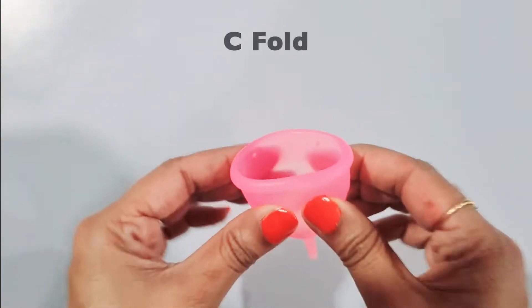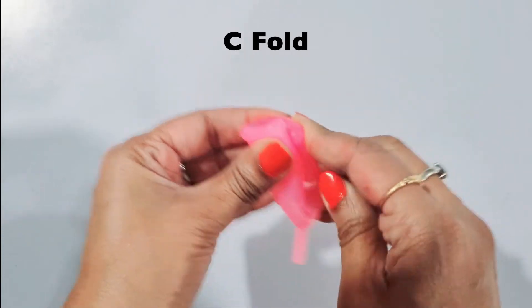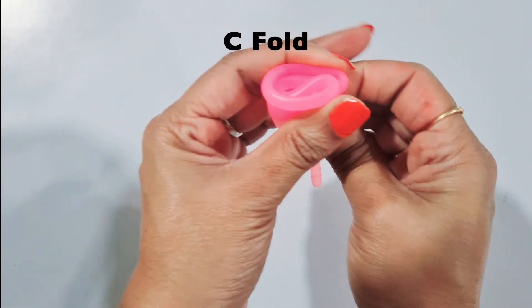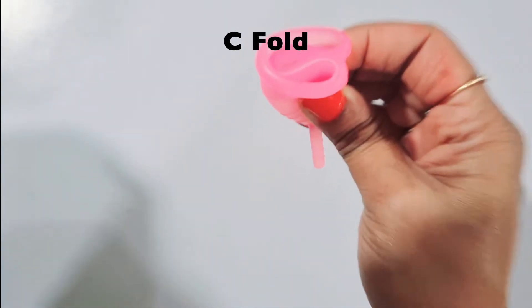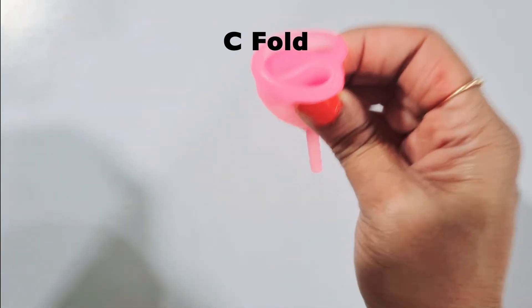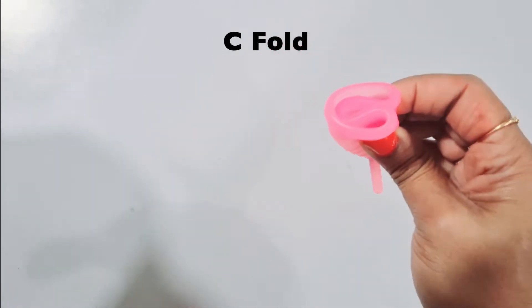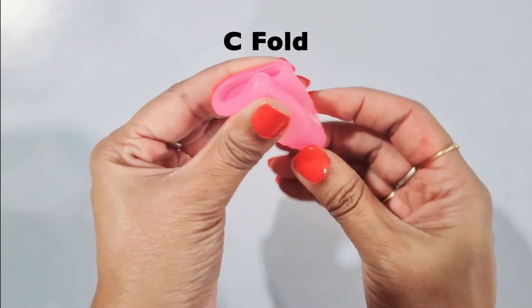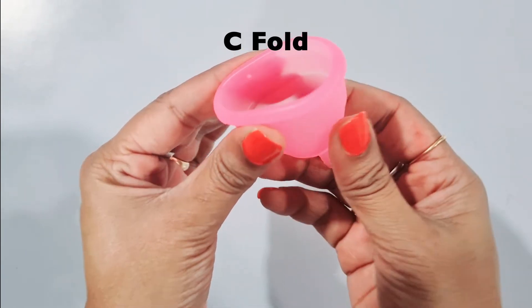Next is the C fold. First squeeze the cup and then fold it into a C shape as you can see here. This is a common fold for women who have been using it for a considerable time or have given vaginal birth. The best part about this fold is that it unfolds very easily once inside the vagina. However, this technique may not be suitable for new users.